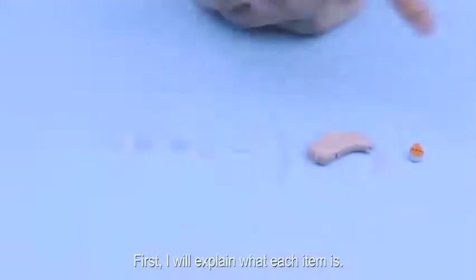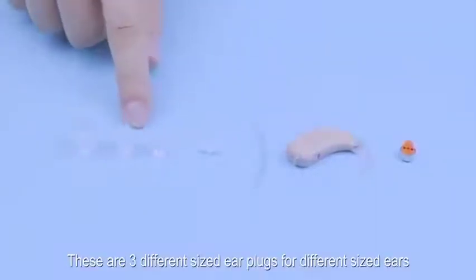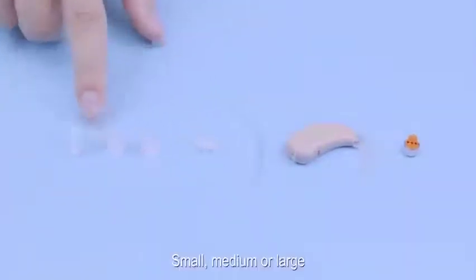First I will explain what each item is. These parts were in the pink plastic bag. These are three different sized earplugs for different sized ears. Please choose whichever earplug size is appropriate for you or your child: small, medium, or large.